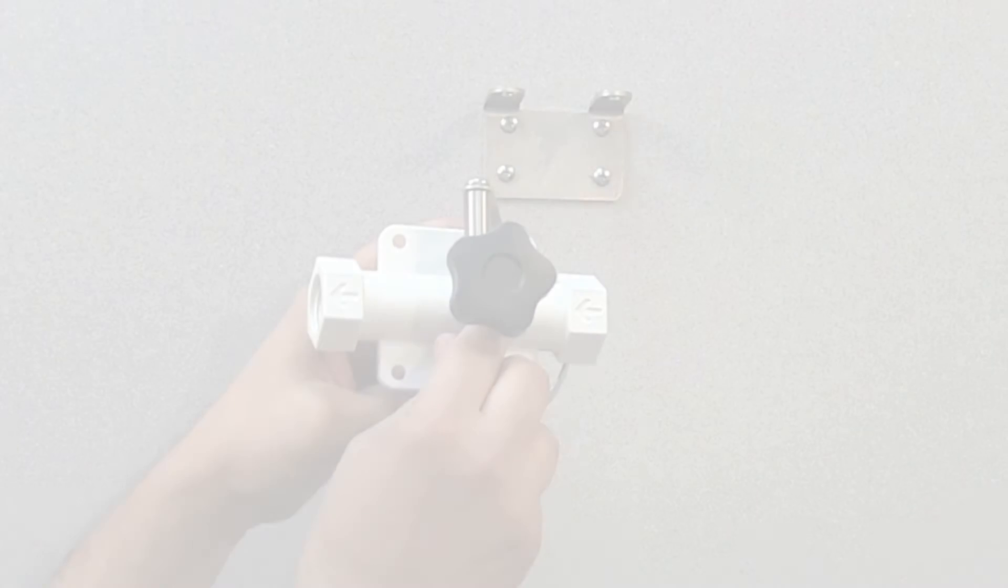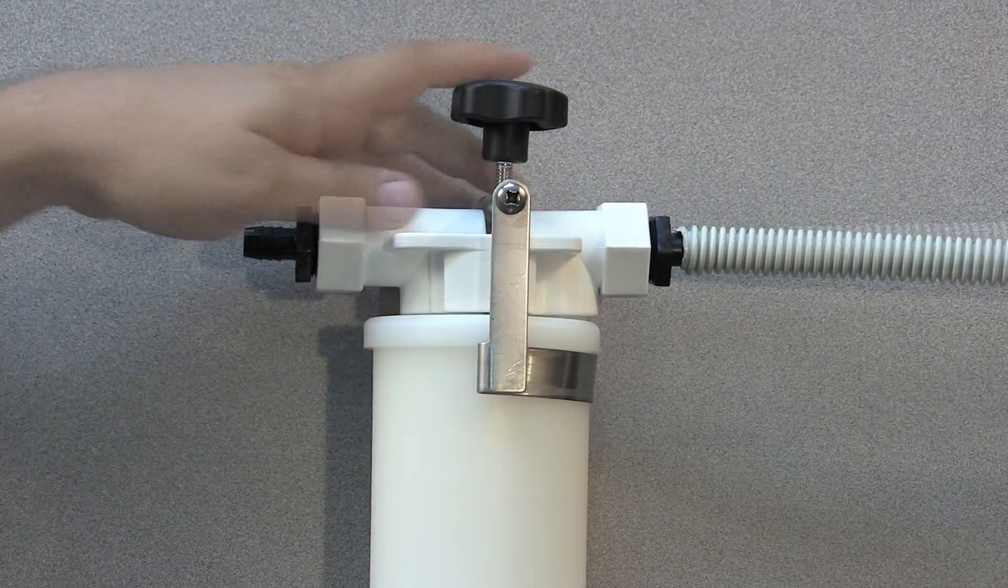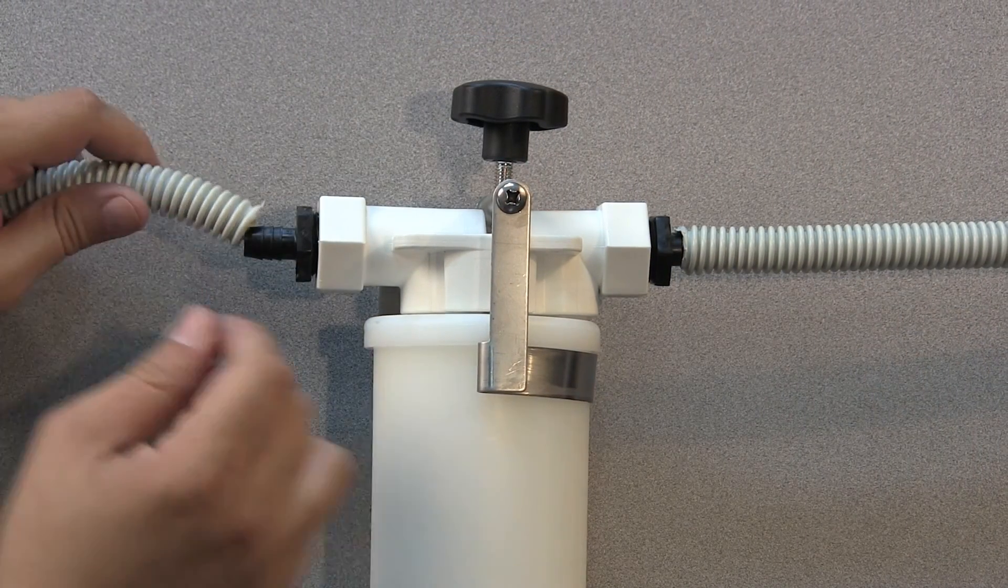Finally, observing the flow direction arrow on the manifold, connect the flexible vacuum hose you spliced to the barb connectors and you're finished! To replace the filter, simply loosen the knob on the retaining bracket and pull the filter assembly away from the manifold.